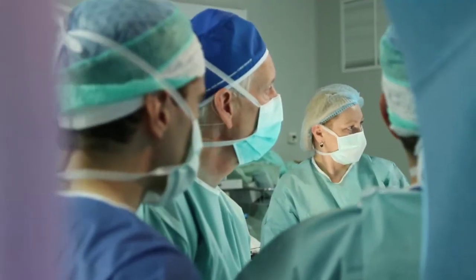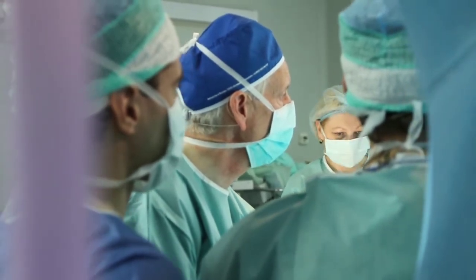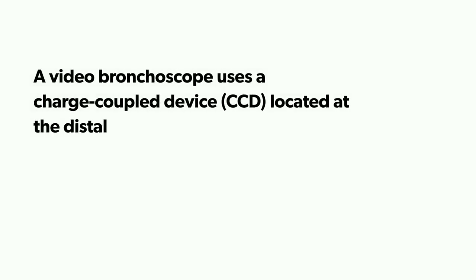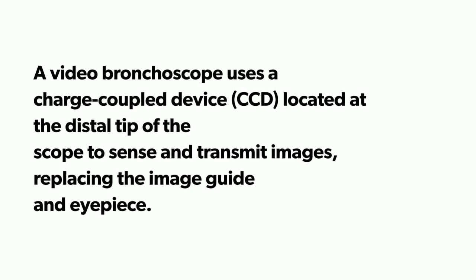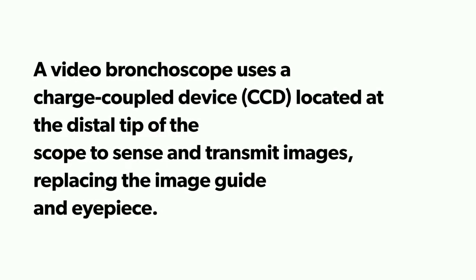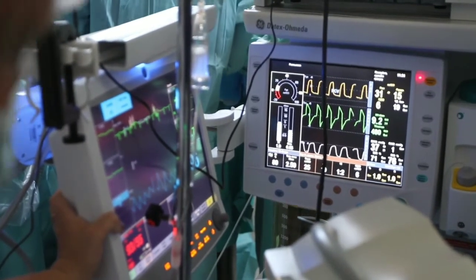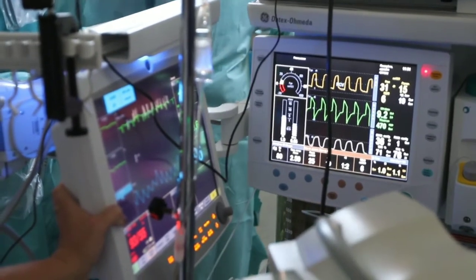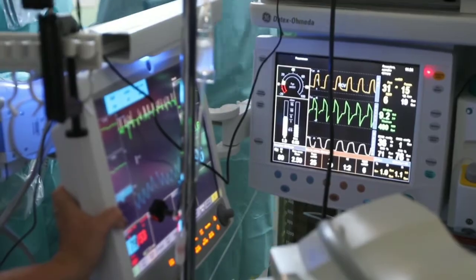The images provided by the bronchoscope can be focused by adjusting the ocular on the scope's proximal housing. A video bronchoscope uses a charge-coupled device, or CCD, located at the distal tip of the scope to sense and transmit images, replacing the image guide and also the eyepiece. These images can then be recorded, printed, stored on digital media or transmitted to another location for simultaneous viewing.